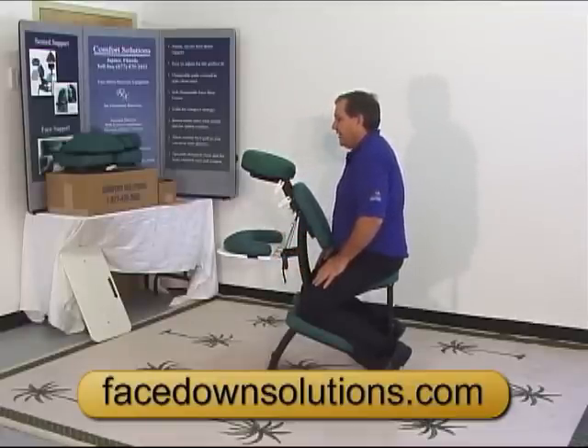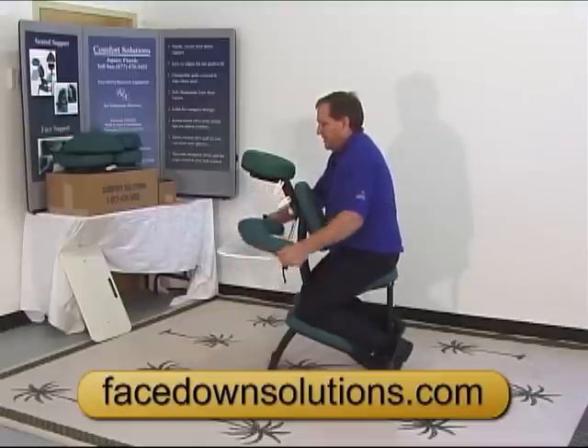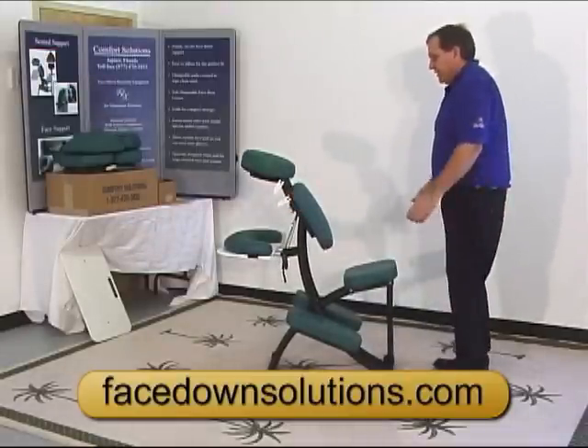That's pretty much all the adjustments on the chair. Everything is Velcroed on so you can take it off, put it back on, or turn it around. When you get out of the chair, push on the chest cushion.